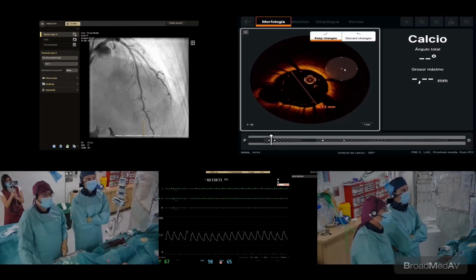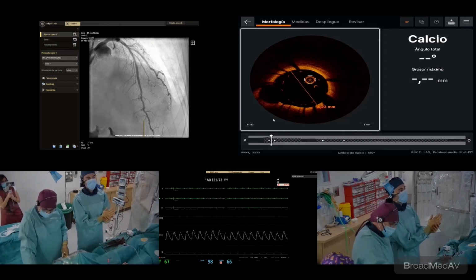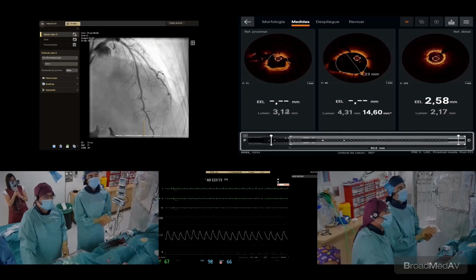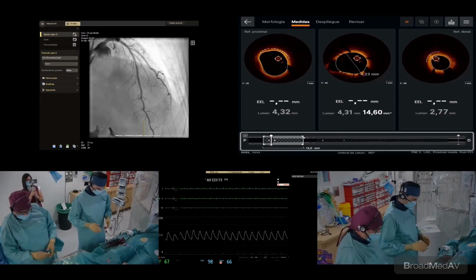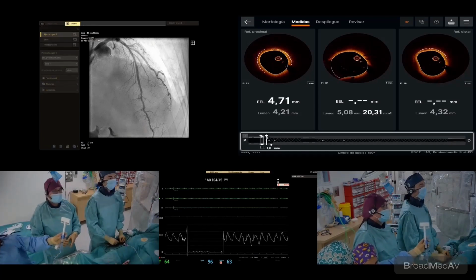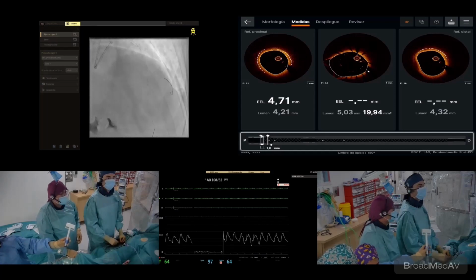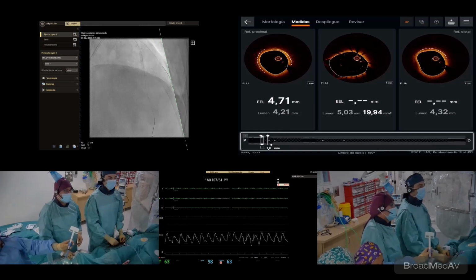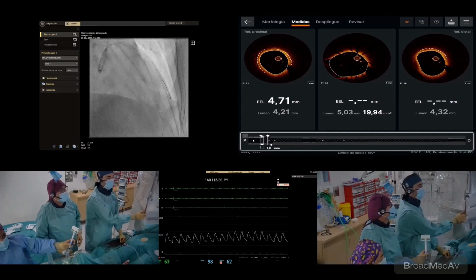We were discussing because to cover the lesion of the LAD, the stent is just at the bifurcation with the circ, as you can see in the OCT, and at that point the vessel is bigger, and we need to post-dilate, probably with a 4.0 balloon. ¿Cuánto se ha metido en el tronco? ¿1 milímetro o menos? It's just the ostium of the circ is my idea. There is no stent at the left main, so the position is perfect. But at the ostial LAD, the diameter is bigger. Yeah. So I'm going to put the caudal right.